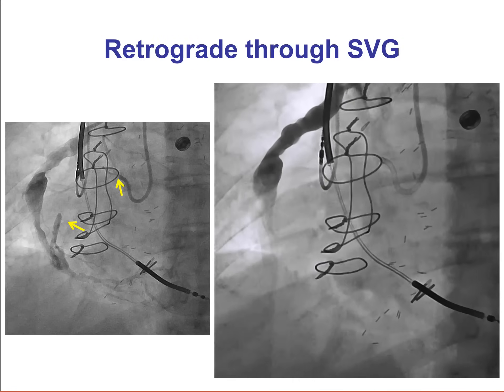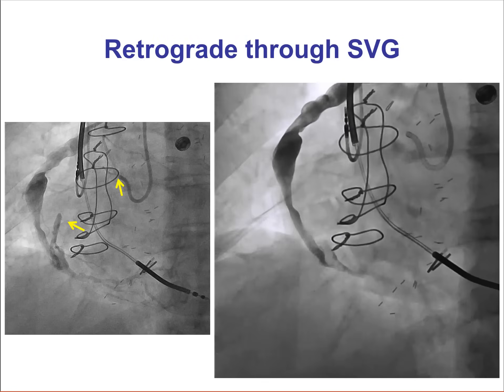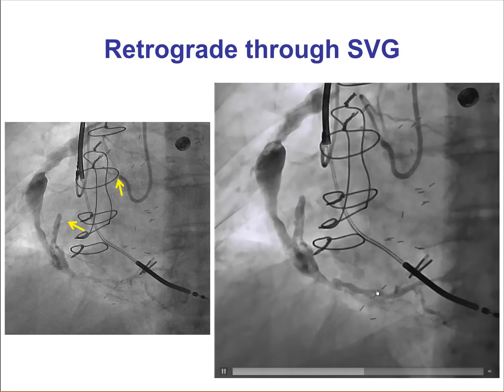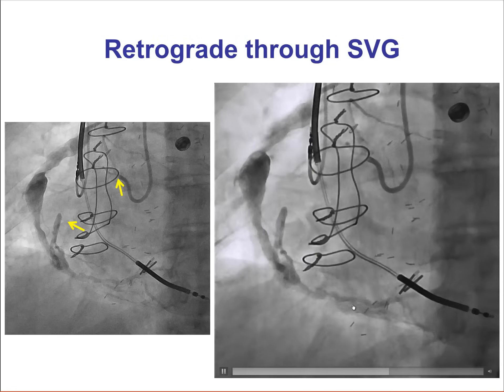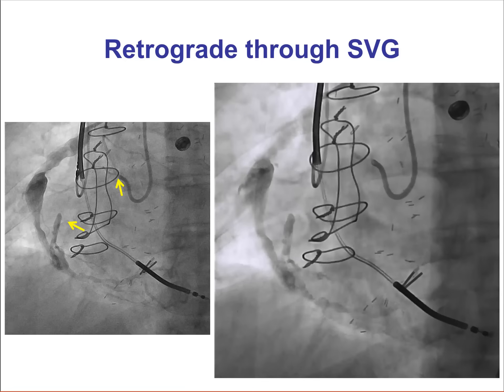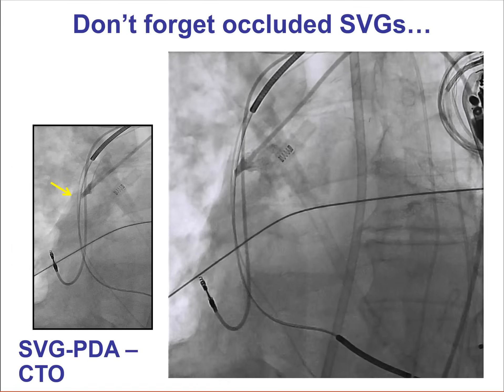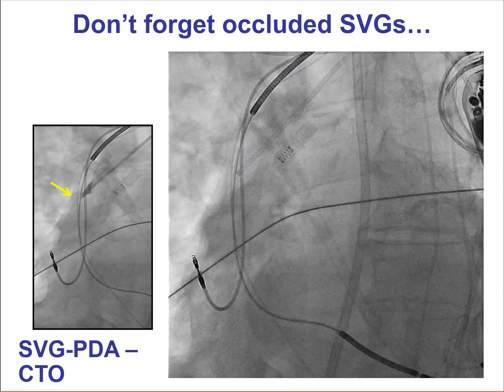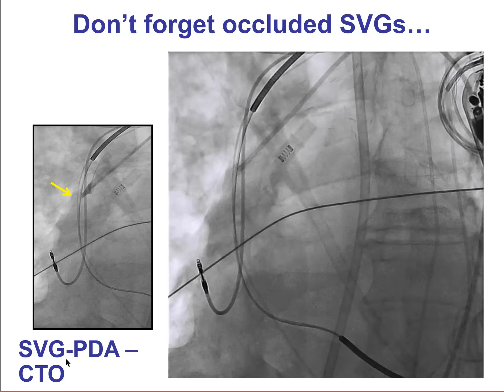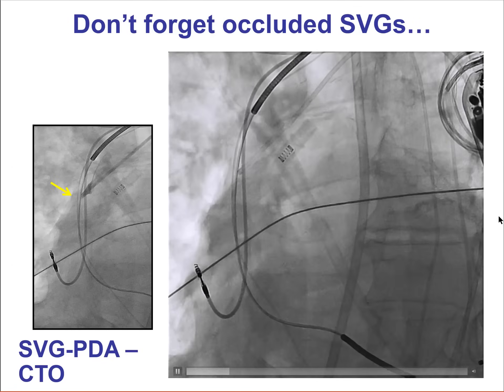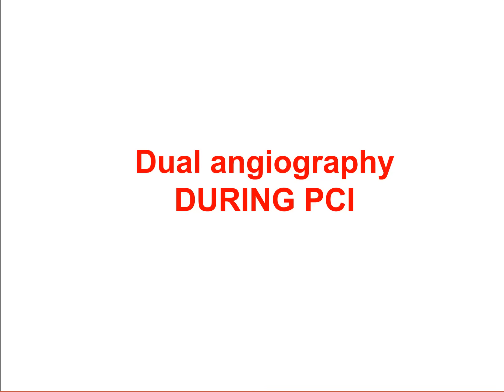We should not forget the vein grafts. This is an example of a degenerated vein graft supplying the right coronary distal to a CTO. We should also not forget the presence of occluded vein grafts, which can sometimes serve as collateral avenues when trying to cross a CTO.